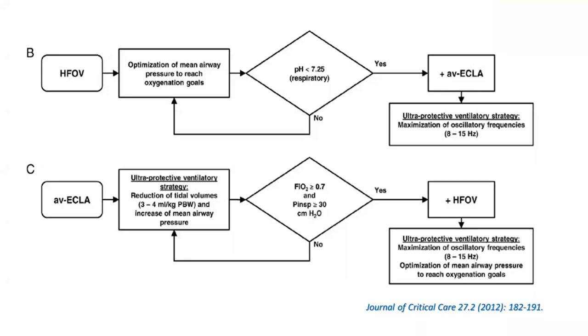Thank you very much. Excellent presentation. My comment is about the general use of the high frequency oscillator, which has changed over maybe the last couple of decades. When the adult side got excited about this new modality, they took it from neonatal. Then they failed to prove it is really more effective than the conventional modes with the OSCAR and OSCILLATE trials. I think there is a lesson we can learn from that: how you include patients in the study and what criteria you decide make them suitable or not. When they compared conventional ventilation with the new strategies they had learned against high frequency, they failed to prove it is better. Actually, it was worse in one of the studies.